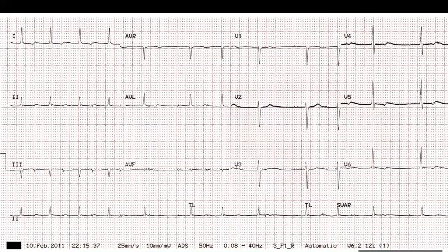So let's recap. Is the pacemaker capturing well? Yes. Is it sensing well? We're talking about the atrial lead. It is just capturing the atrium, just like AAI. Is it sensing the atrium? It is pacing. Then pacing and capturing well, and this is the first job of the pacemaker. The second is the sensing. Is it sensing well?